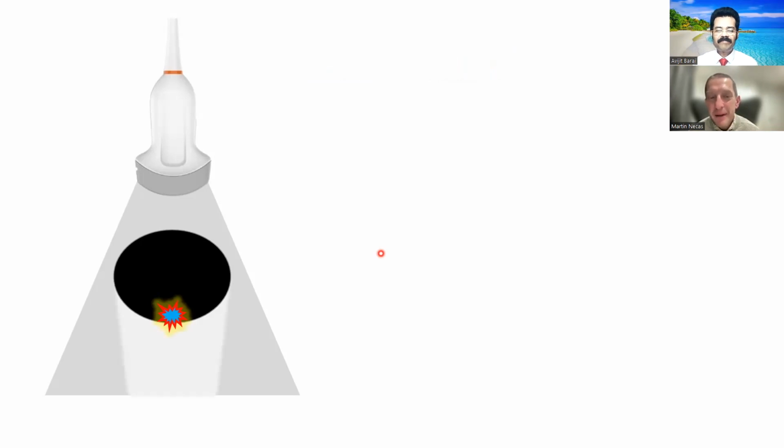And that's probably because twinkling artifact arises when the structure is very rough and irregular. As the beam reflects off the structure, different parts of the beam are reflecting at different times because the structure is highly irregular. This causes phase shift and generates Doppler content that the machine then interprets, of course, as intense color.